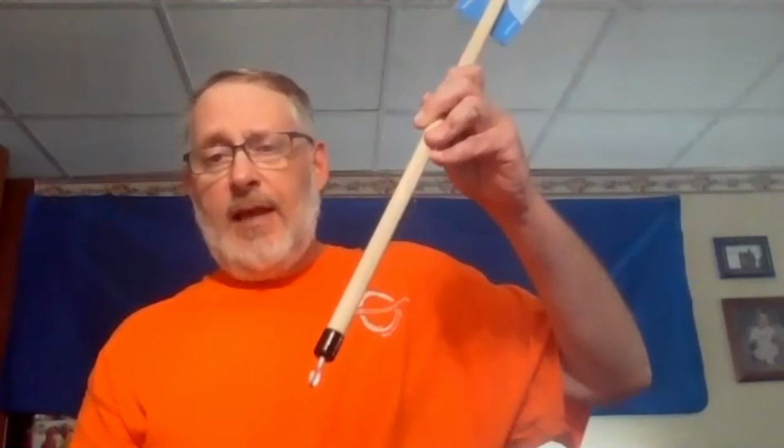But what this does, it helps you with your zippers. So as you can see, that little hook right there would go into your zipper. If you look on your zipper, there's a hole. So this C hook would fit right into there and help you pull up your zipper, whether it's a pair of pants or a coat or anything that would have a zipper on it. Like I said, pretty durable, made of metal, coated in plastic, a nice little item to have around.